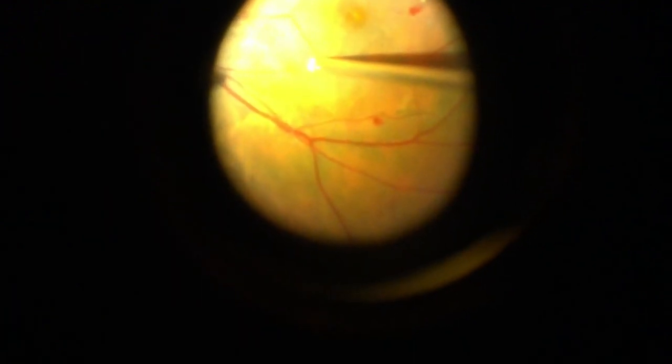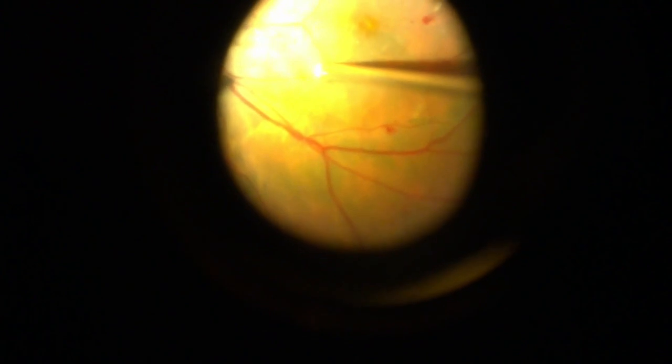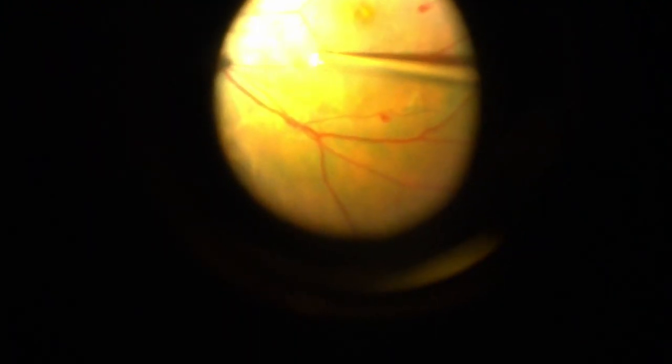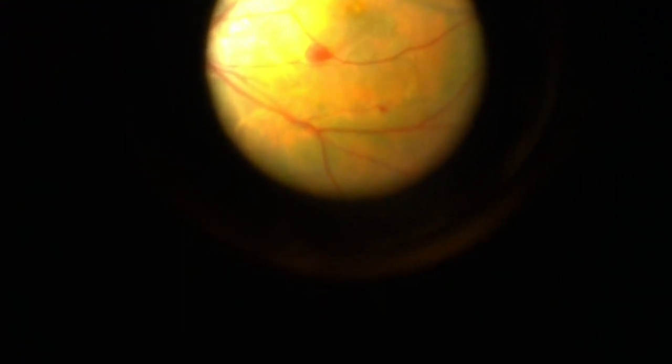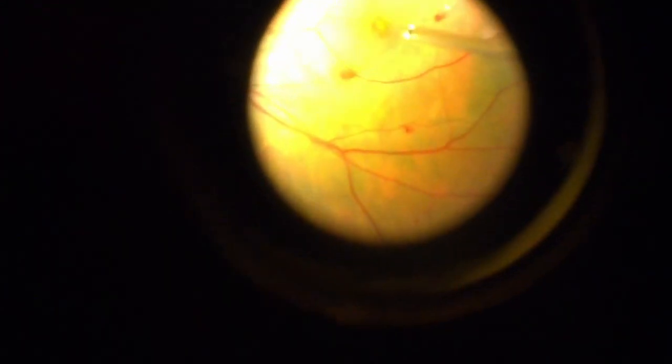And I'm going to show you a little bit more of this technique. I'm going to peel this nasal piece of the ERM. So you just come down and hit the floor of the retina, rub up on these edges. You can see how that would just do such a nice job of peeling up almost just under tension of the suction. The trick is engaging the edge.